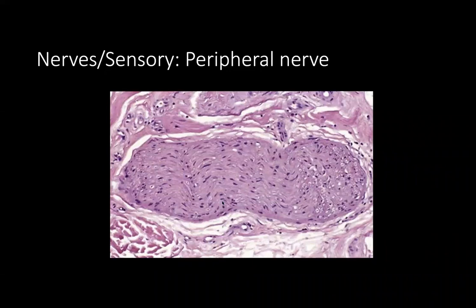So it's important to recognize neural cells normally, but also when you're looking for perineural invasion in tumors like squamous cell carcinoma, basal cell carcinoma, or microcystic adnexal carcinoma. These tumors actually go perineural. And it's important to be able to recognize that there are neoplastic cells infiltrating the normal nerves.